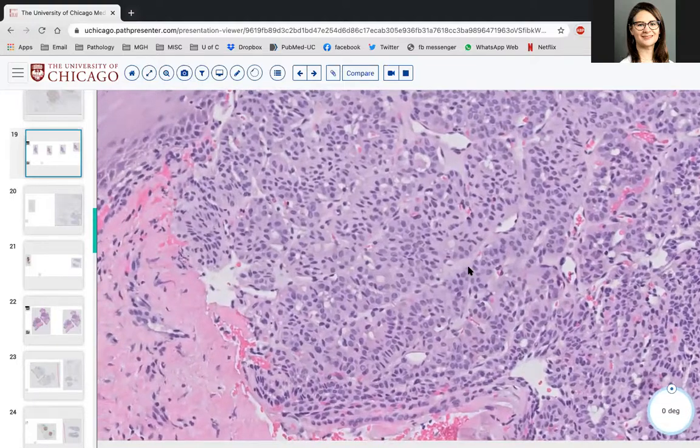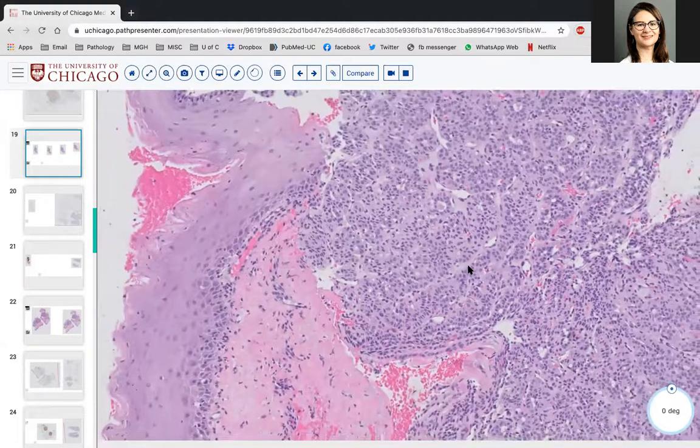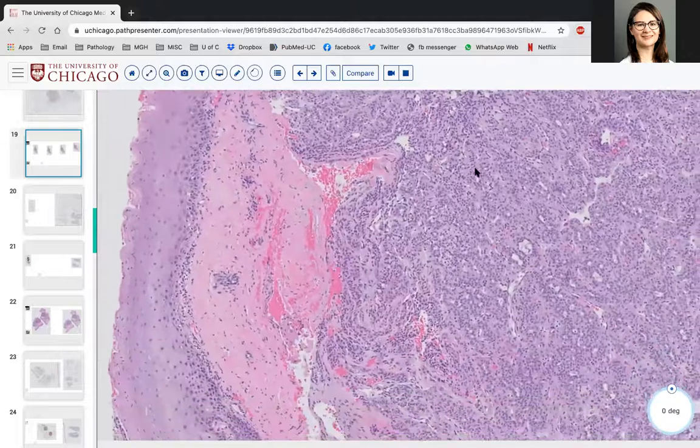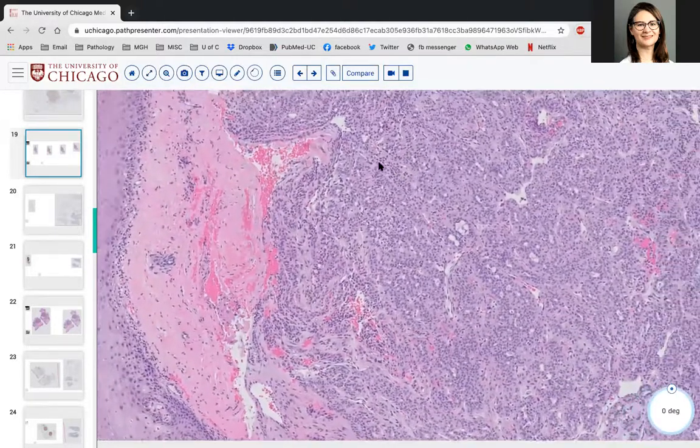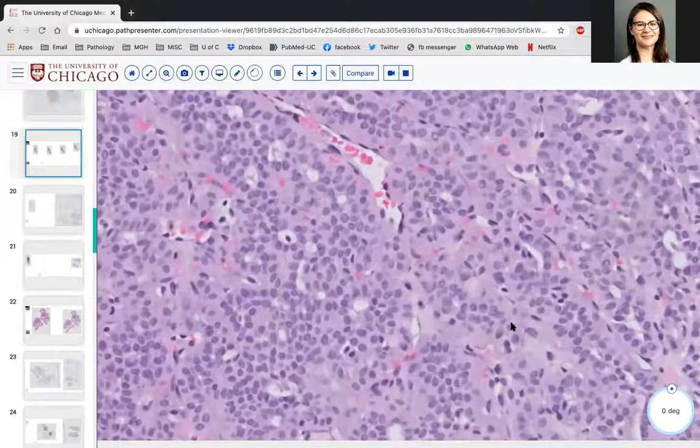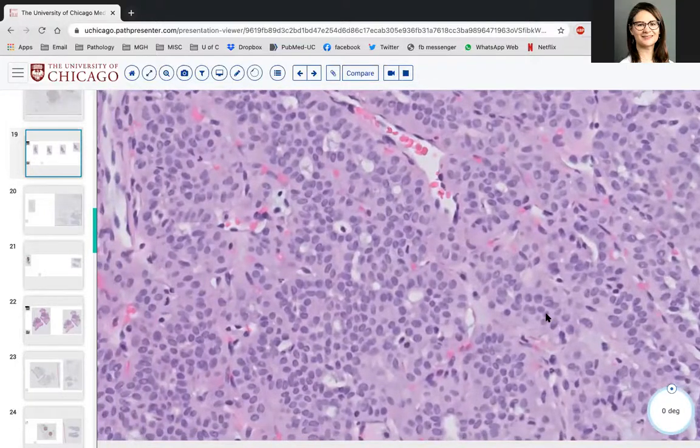So yes, it does have this cystic or microsecretory type of pattern. So it can definitely fall into that differential diagnosis, but it's also very cellular. So it can also fall into the basaloid category, right? And within the basaloid category, polymorphous is one of the only ones that does not have a biphasic population.